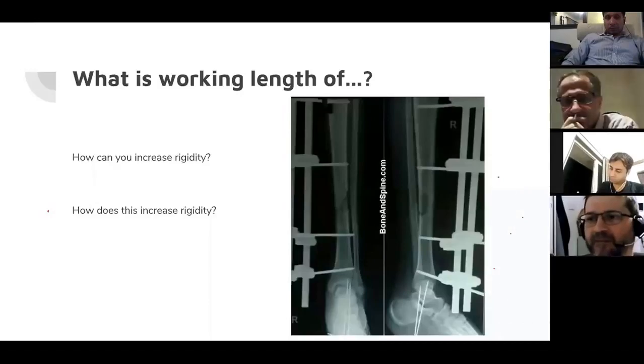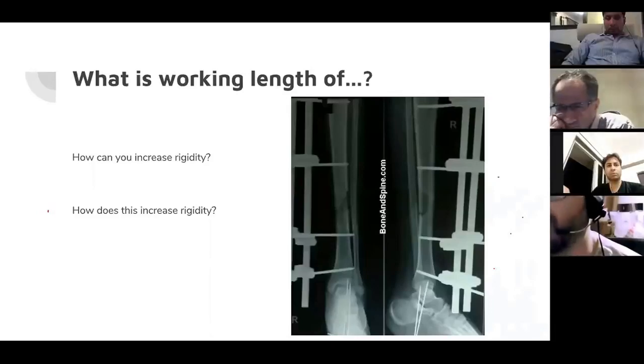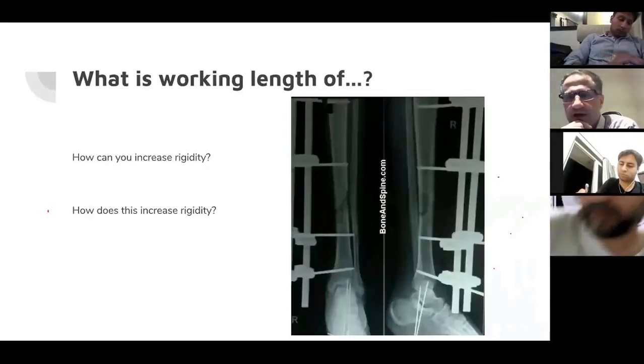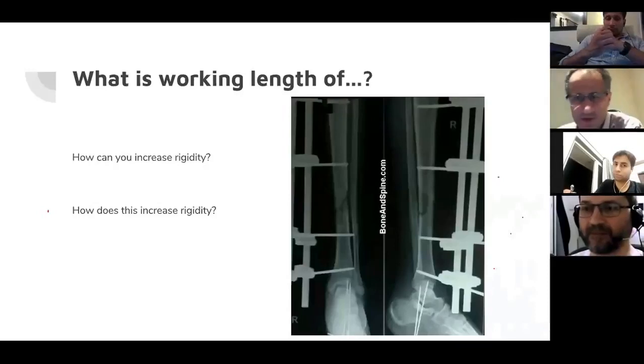And anything else? Can you do anything to the fracture? Yes, anatomical reduction. That adds to the bone stability, and that takes some of the weight. So if you have good contact of the fracture itself, then the device would act as a load sharing rather than a load bearing, which means the amount of forces that goes through the external fixator construct is less because of the contact between the two fragments. So changing your construct to a load sharing construct will increase your rigidity overall. Excellent. I like beautiful phrasing and beautiful understanding. Well done, Abdullah.